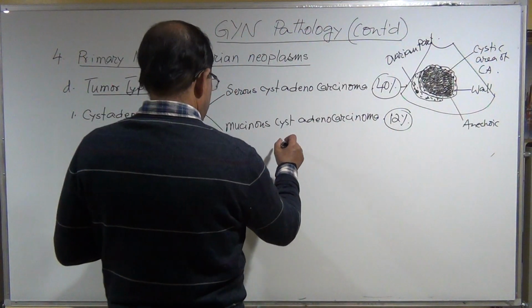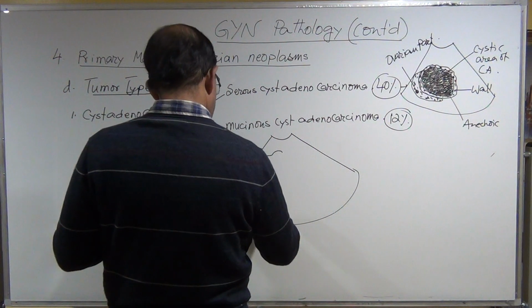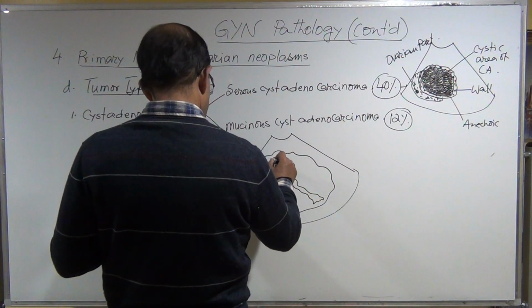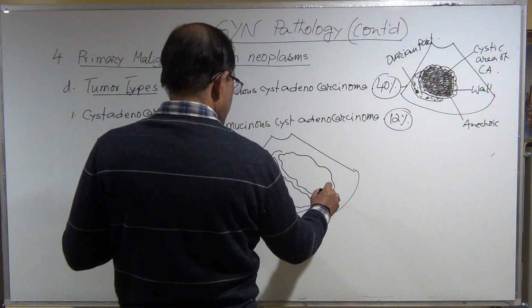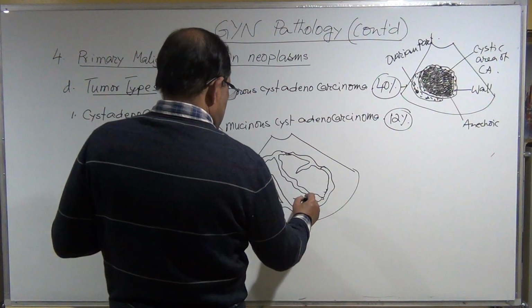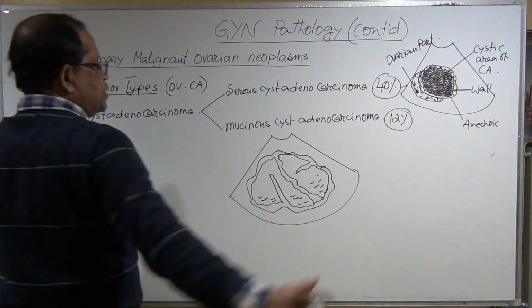So that means it's such a big one. Okay, this is inside the ovary, and now you don't see the ovary.